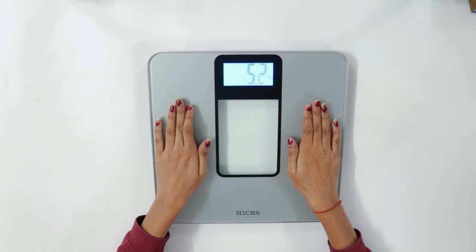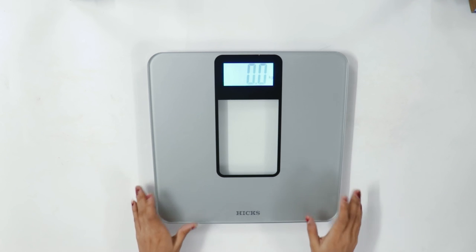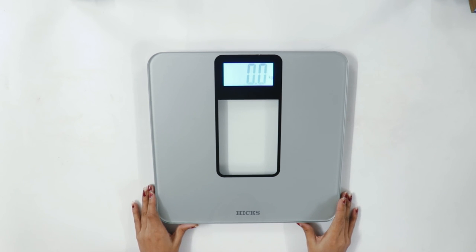The machine has a digital display. So here we come to an end of this unboxing video of the Hicks weight machine.